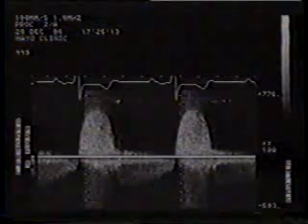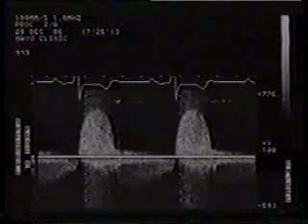The third step in calculating the aortic valve area is to measure the maximum aortic velocity. In this case, all of the standard transducer positions were utilized. The maximum velocity was obtained from the right parasternal position, and the corresponding velocity spectrum is displayed here. The peak systolic velocity is 5.5 meters per second. This signal below the baseline is aortic regurgitation.